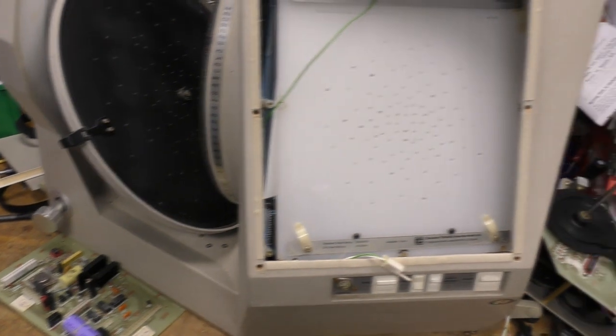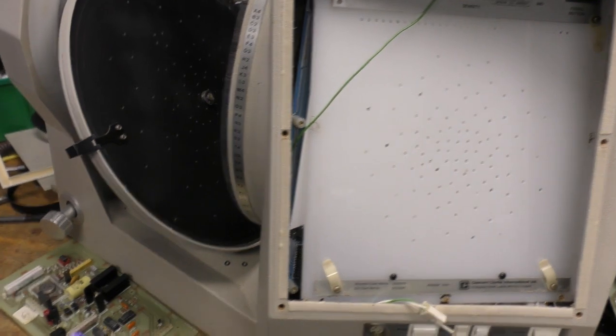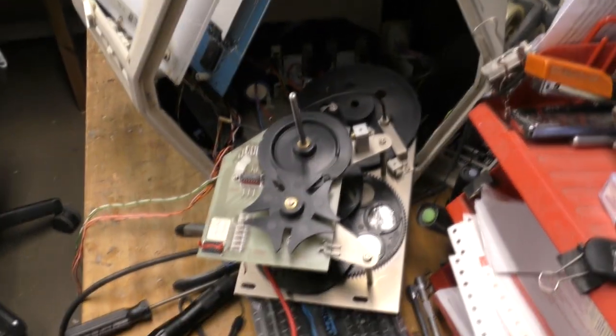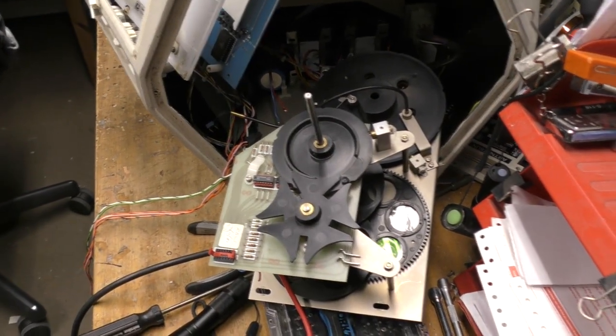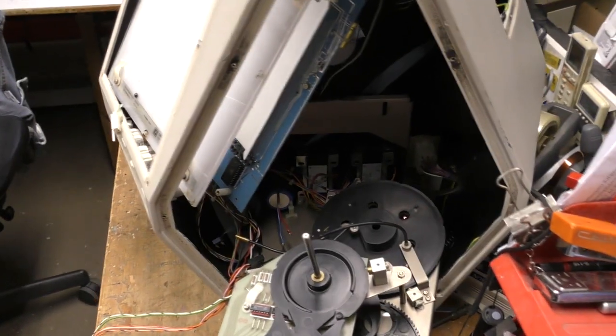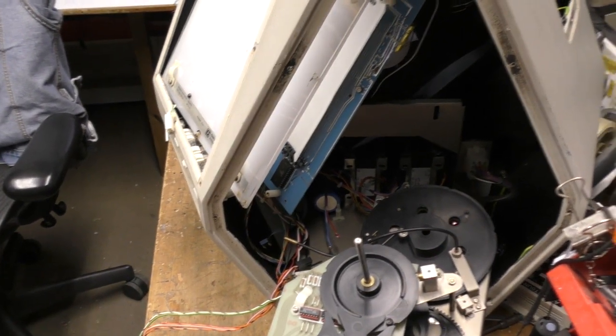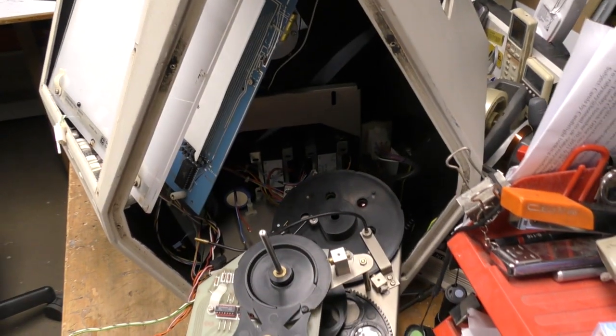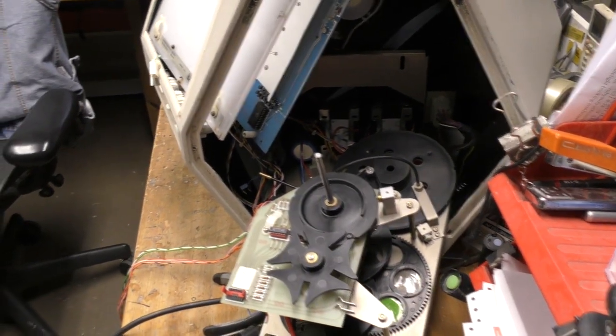Okay, so like I said, this was probably one of the most annoying things I've ever taken apart. It seemed like every screw had a cascade of washers and non-captive nuts and clips flying all over the place. I had to cut almost every cable tie in the thing just to get the board out. Maybe it's just because of the vintage, but I found it such an annoying bit of design. I suppose with a small volume thing, maybe it's not worth spending too much time optimizing it, so they just stick it together however is easiest.